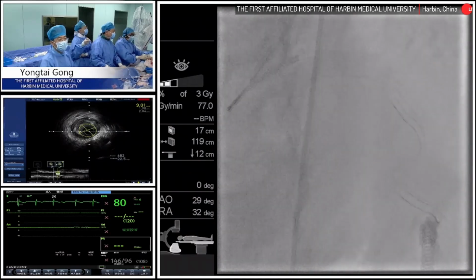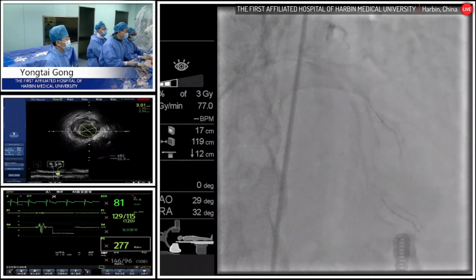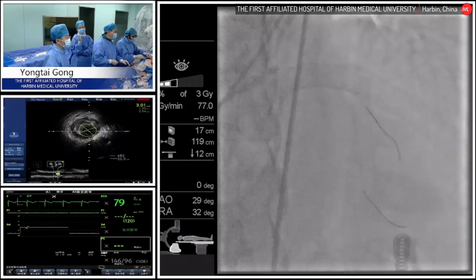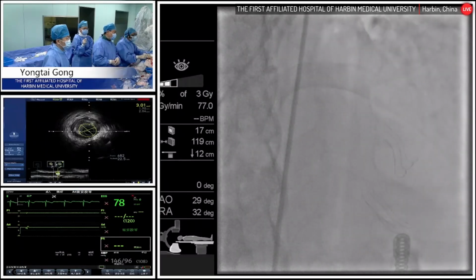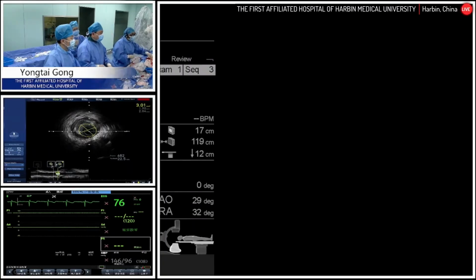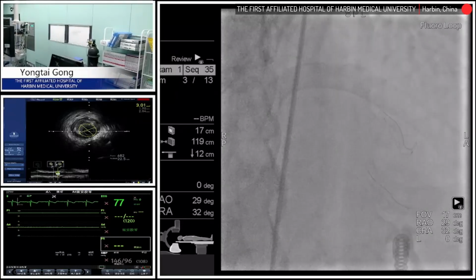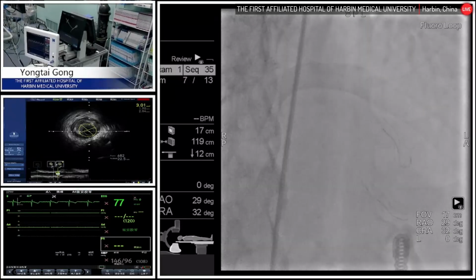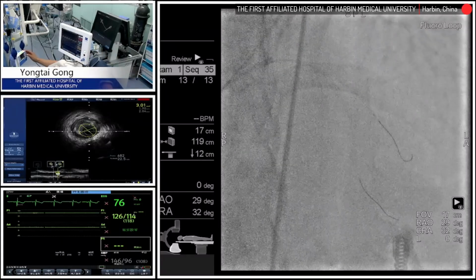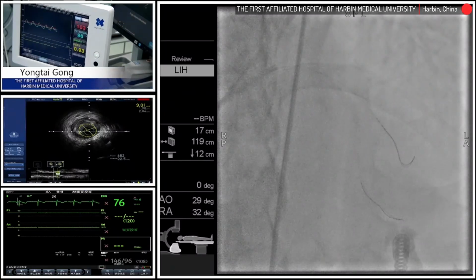Can we see the FFR screen? Okay, you can see the microcatheter was sent through the stenosis very smoothly to the distal part of the diagonal branch. So this is one of the advantages of the microcatheter-based FFR, I think, because you can use it on a workhorse wire. So you can do it frequently, and also do not worry that the FFR wire is passing through with difficulty. Okay. I think that the resting Pd/Pa is 0.93, so it's hard to say. We know that the cutoff value for the resting Pd/Pa is 0.92, so we can tell this is a very focal, very short stenosis at the diagonal ostium. What the FFR value is going to be.